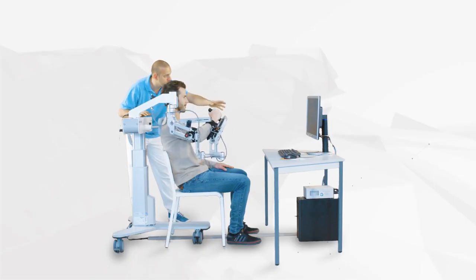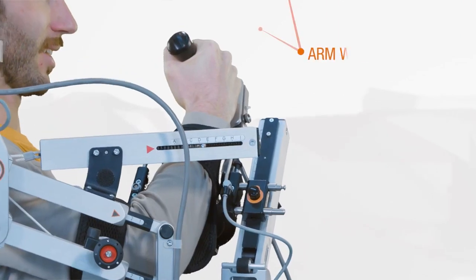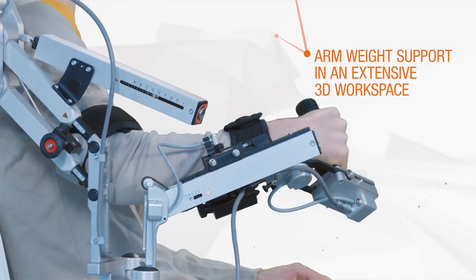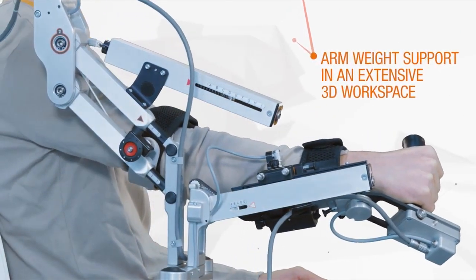The Armeo devices enable patients to perform highly repetitive functional therapy by supporting their arm weight and by guiding the movement of their arm.